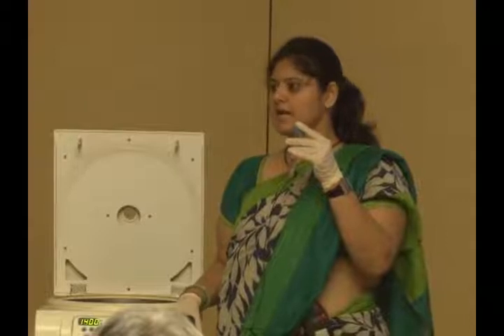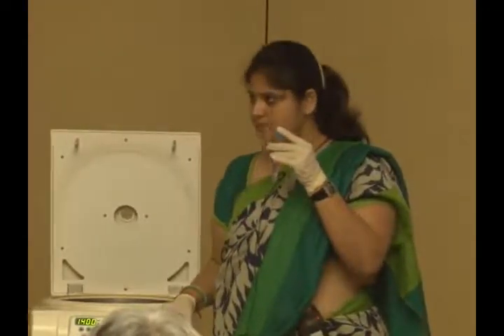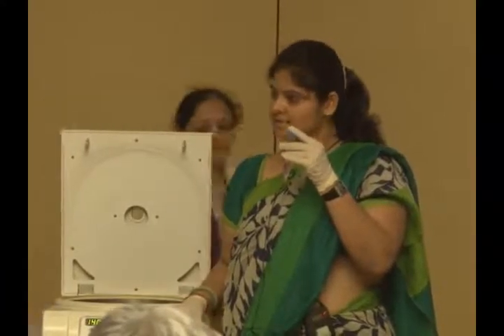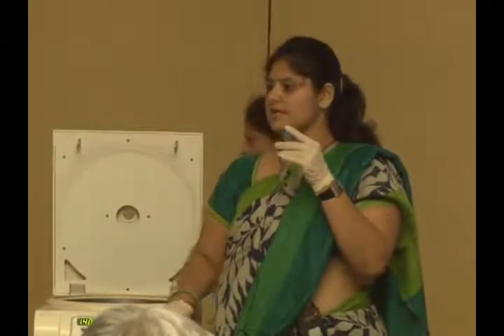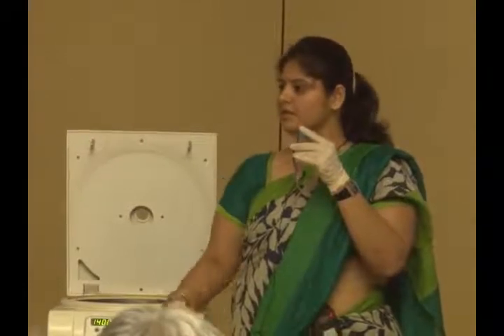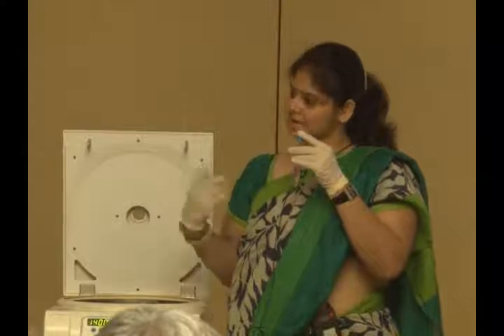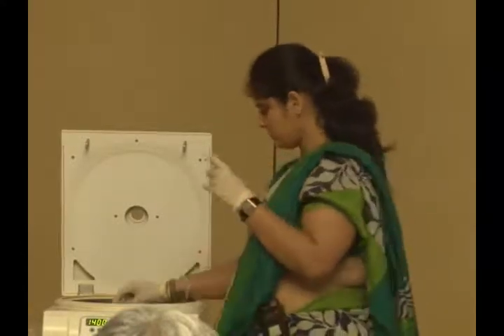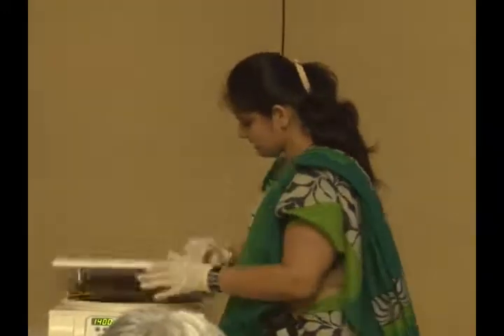But don't increase the RPM above 1500, because if you increase the RPM, it can cause damage to the sperm. With the suggested time and suggested RPM, there is less chance of damage to the sperm. If you increase the time and the RPM in any centrifugation, it can create ROS as well, plus damage to the head of the sperm. Now we'll counterbalance the tube and put it inside the centrifuge.